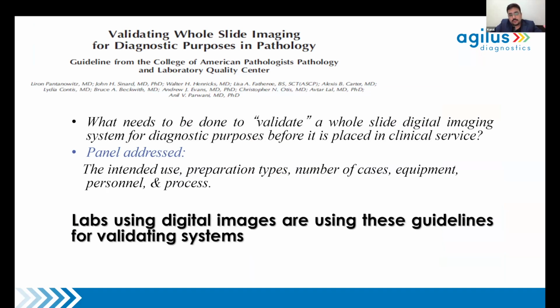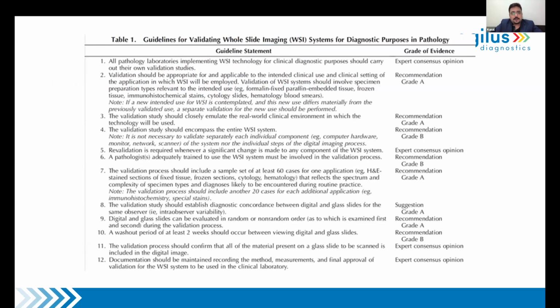Then you need validation. Now, validation for a WSI has to be both for the scanner as well as for the computer systems. There are various guidelines which have been provided by the European Union and the College of American Pathologists. I will not go into reading all these guidelines. These are very well available online. So anybody who intends to create a digital laboratory or digital pathology reporting should definitely go through these guidelines.